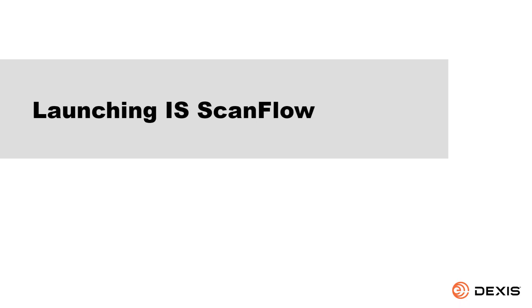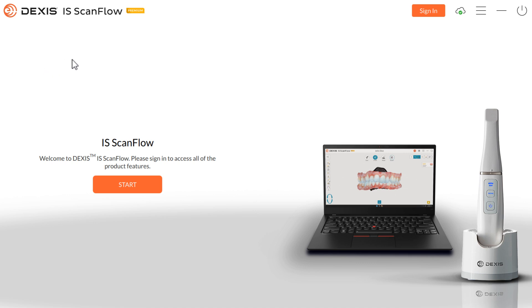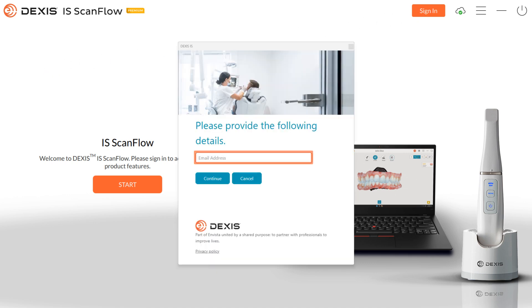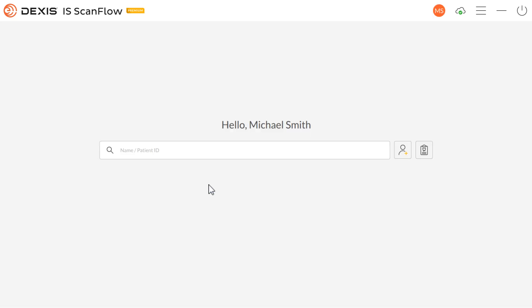Launching IS ScanFlow. Double-click your DEXUS IS ScanFlow icon. Click Sign In. Enter your registered email address. Click Continue. If you do not have an account, click Sign Up Now and create an account. Enter your password. Click Sign In. The Welcome window is displayed.